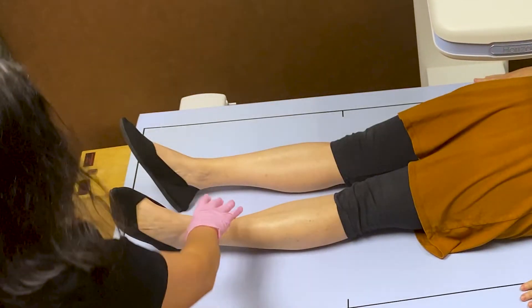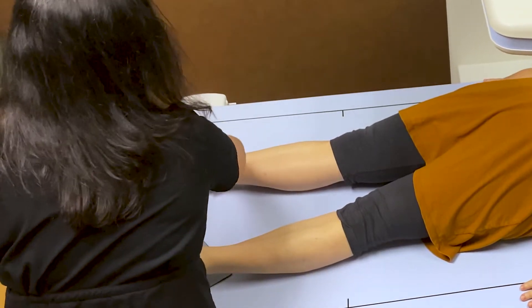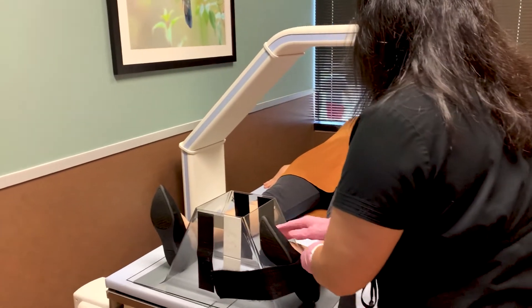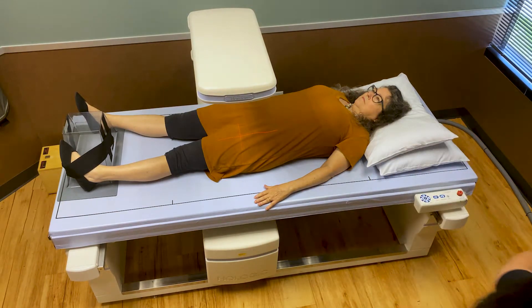The first exam is going to be of your left hip. I'm going to lift your left foot and put it here, and lift your right foot and put it way over here. I'll turn your left foot in and strap it in to help hold your leg in place. Okay, we're going to get started.